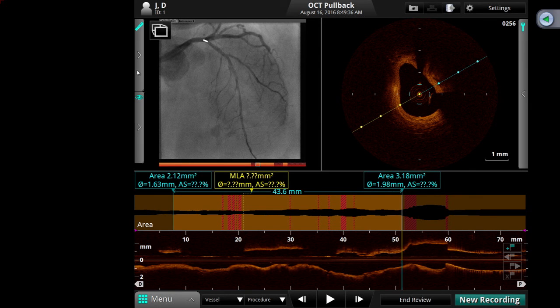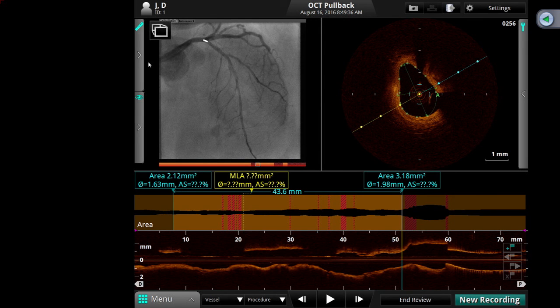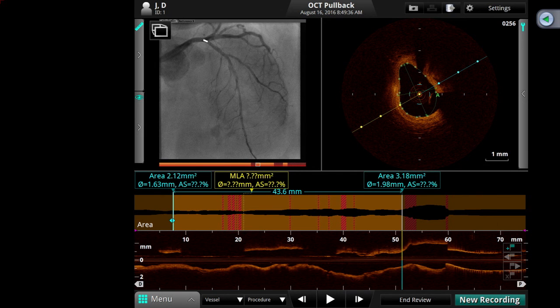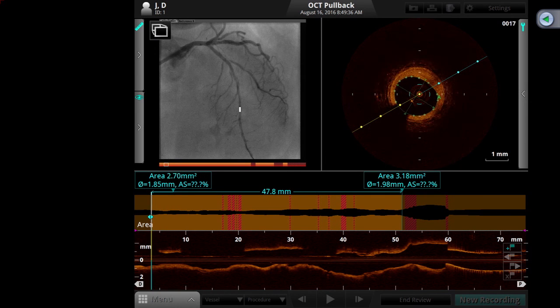You mean today's case? No, right there in the mid portion, do you think it requires an angiosculpt as you were thinking before? Mean vessel diameter is 1.98. I said 2.2. Maximum is 2.6. But then you want to put a 3.0. Right. So how is the less experienced operator supposed to be making decisions based on this?